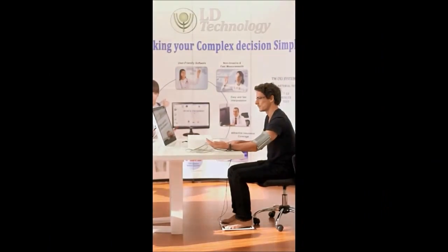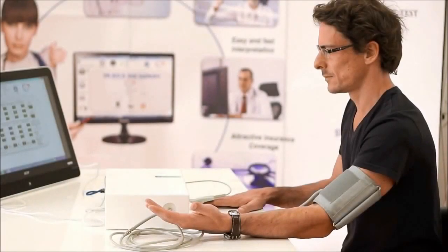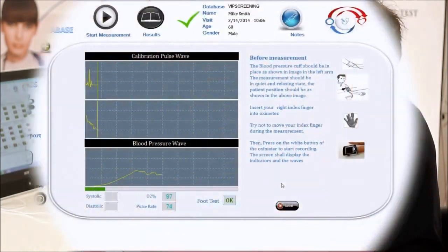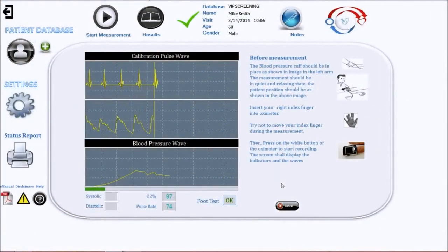Patient is sitting relaxed and breathing normally. Heart rate, pulse wave, and blood pressure are adjusted at this time.